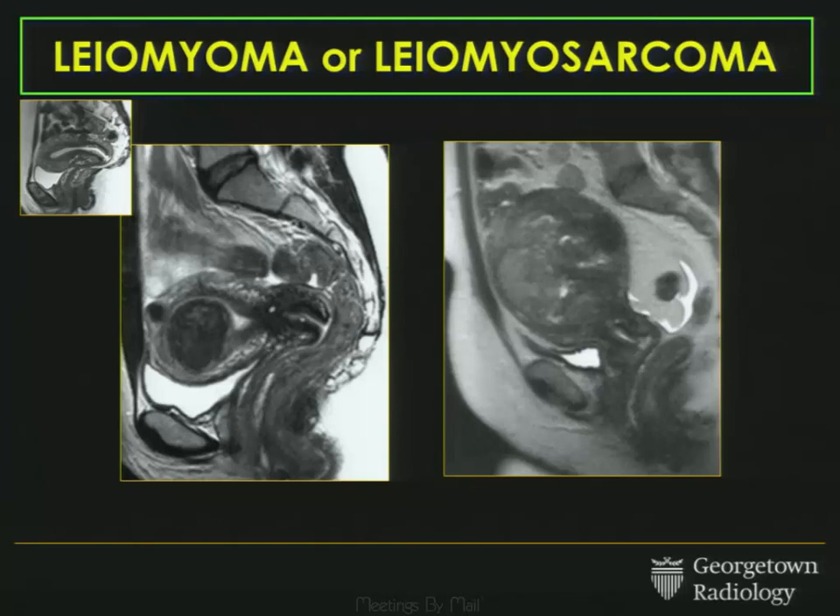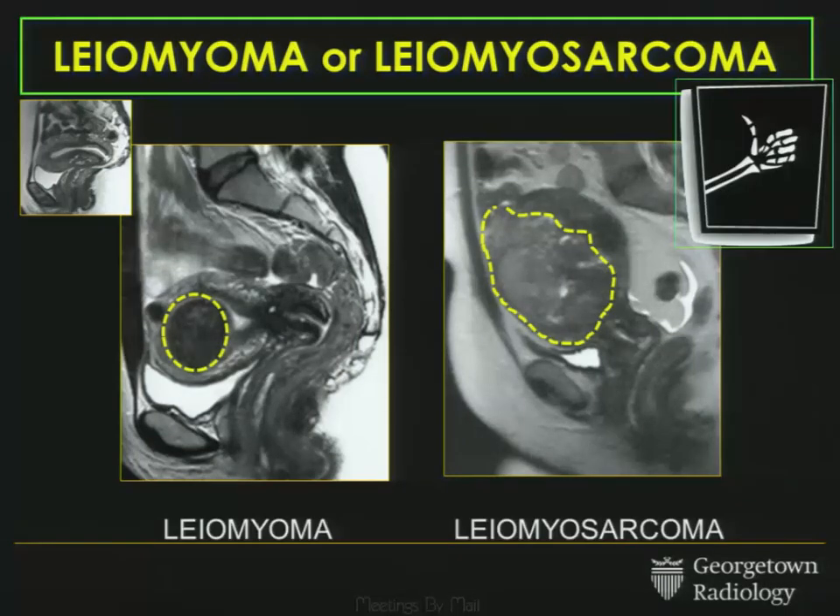The second case is kind of similar — two different patients, two different dominant lesions, the one on the left and the one on the right. And I think we'd all agree again: the one on the left is a fibroid, a leiomyoma. The one on the right is more worrisome, perhaps a sarcoma.